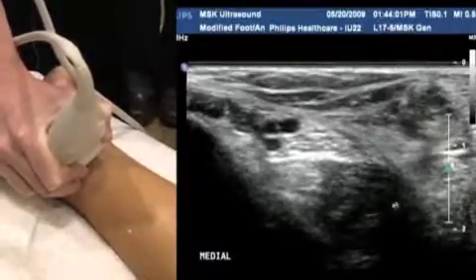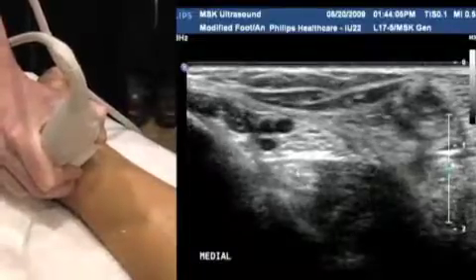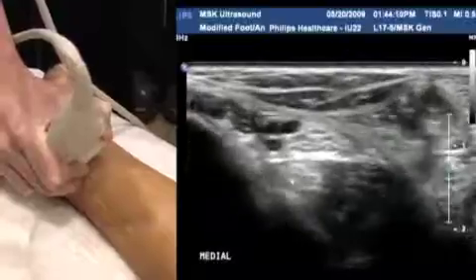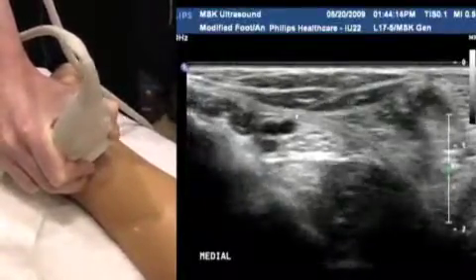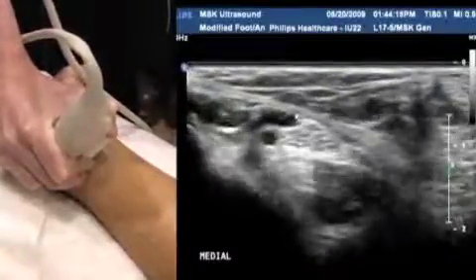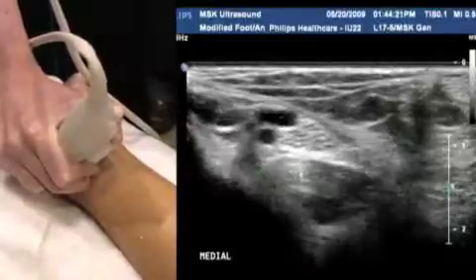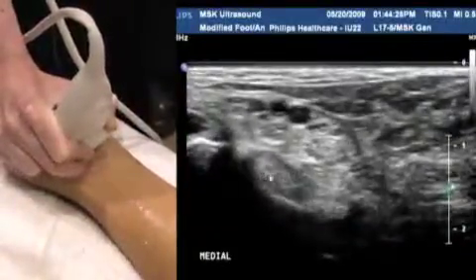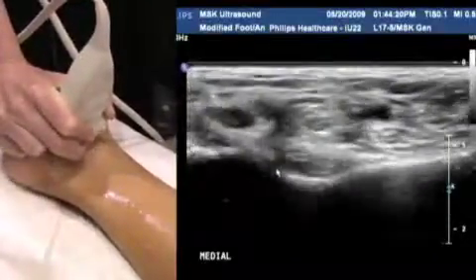It's obviously a lot larger than the tendon itself, so sometimes it's easy to isolate the muscle and then really focus your eye a little bit more superficially to the tendon here. And this sits back in its calcaneal groove back here, below the tarsal tunnel. We're going to follow flexor hallucis again, heel toeing all the way down through its muscle to the groove here. There it is here. All the way underneath the foot.